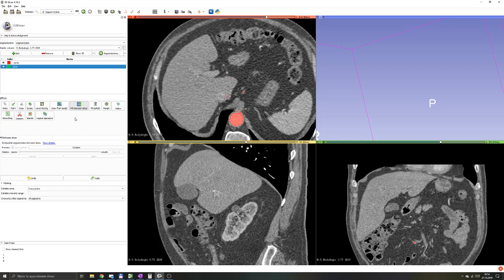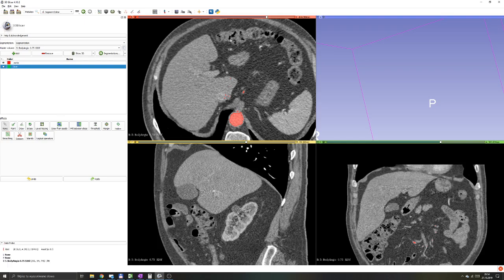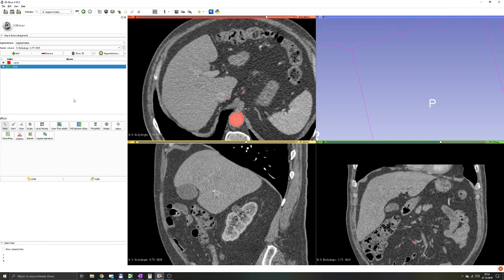I'm skipping the description of the islands, logical operators, hollow, margin. Those are not very difficult tools to understand, but they are definitely not the most popular and they are more advanced. You'll probably want to look into them if you're making more advanced segmentations, but those effects are all pre-built into 3D Slicer.